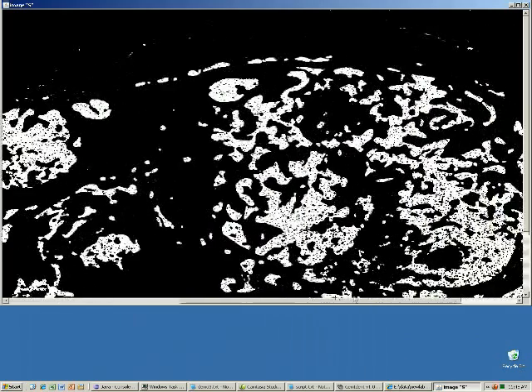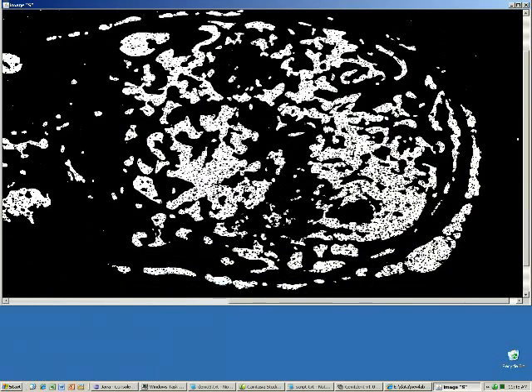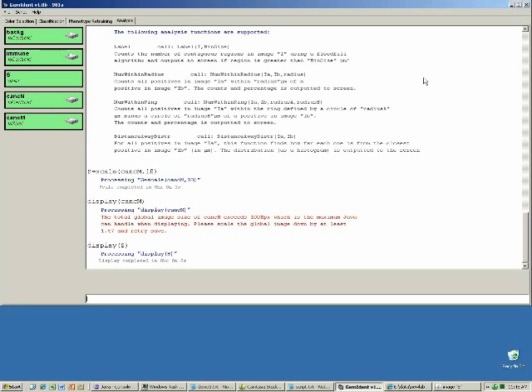It may be interesting to count the number of blobs and get an idea of their locations and size. The label function would do just that. We need to define a minimum size. I'll assume for the moment that a typical cancer cell has a radius of 10 microns. Therefore, the size would be about 310 microns squared.